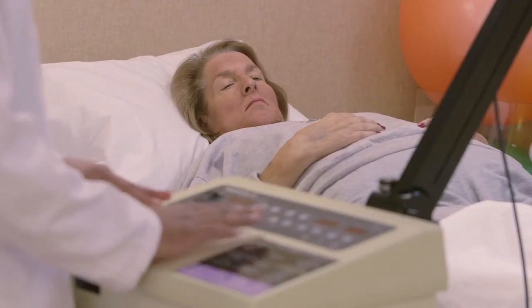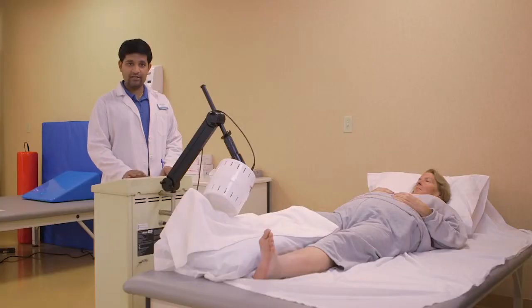We use this modality with a lot of other patients, but there are certain procedures and protocols we use and don't use on certain conditions. For example, when the patient has a pacemaker or defibrillator, we don't use this modality at all.